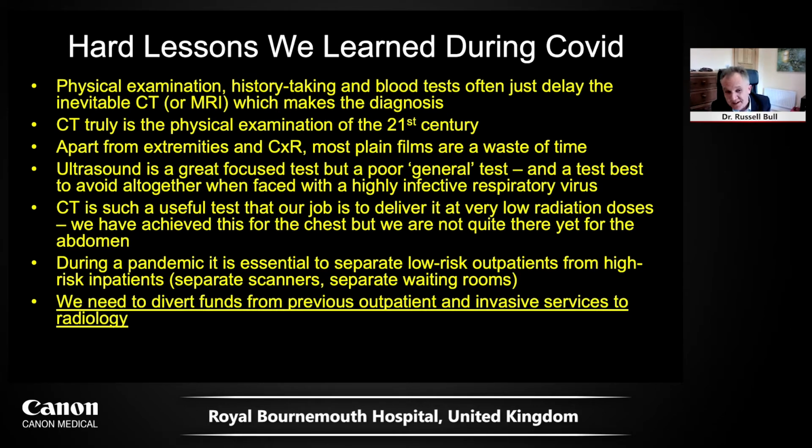Apart from the extremities and chest x-ray, we did discover, a rather hard lesson, that most plain films are a complete waste of time. So we've stopped doing a lot of them, particularly lumbar spines for trauma, cervical spines for trauma. They were never very good tests. Ultrasound, no, it's a great focused test. I'm not knocking ultrasound here, but it's an absolutely terrible general test just to see if there's anything wrong with someone. And we always knew that, but coronavirus made that even worse.